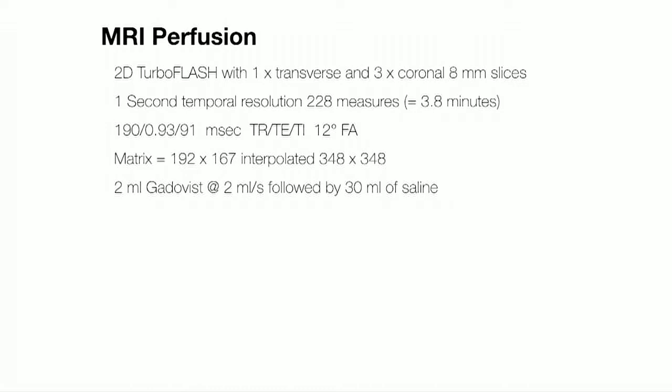I say, we're very, very particular about breath holding, and we don't want to use any of the SmartPrep or bolus track or any of these things for the renal MRA, because invariably what happens is if you're using SmartPrep for renal MRA, there's all this noise going on, the gradients are slamming away while the contrast is going in, the patient's a bit panicky, he doesn't know whether he can hear, the technologist doesn't know whether the patient can hear, the patient may be breathing out when the technologist says to breathe in, or they're breathing in when the technologist says to breathe out, and it's all a bit of a disaster.